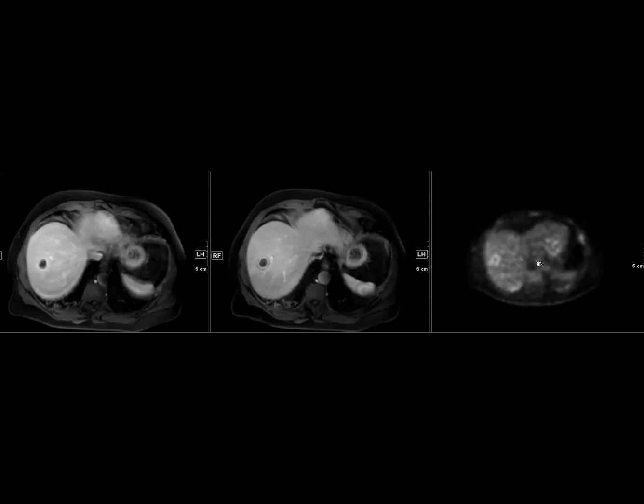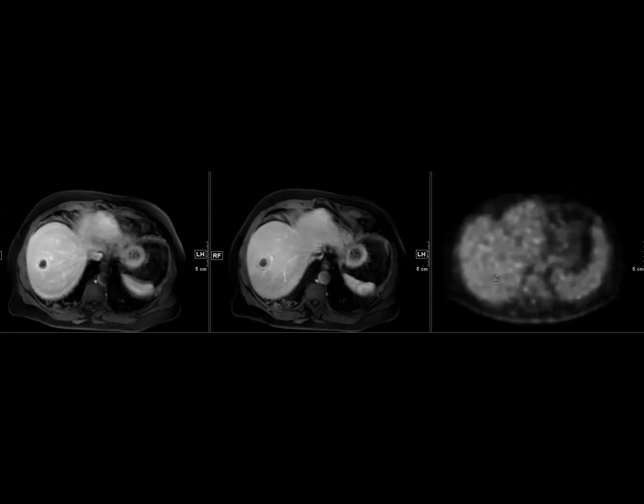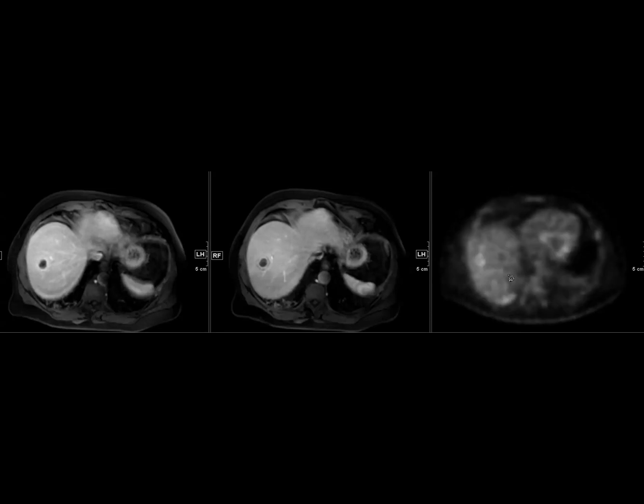So then we send the patient for the PET, and again we see that this larger lesion does have ring enhancing, hypermetabolic periphery corresponding to what we see in the MR. And the little one probably is not as well seen. So it was read as METs versus abscess. So we're still in the same kind of position with this patient.